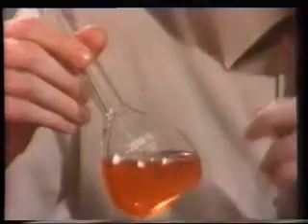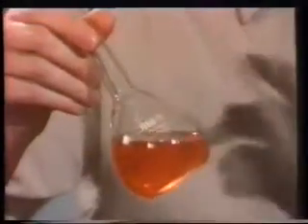Now let's just go back to colour for a moment or two, because there are some things that can produce changes in the colour of urine which you need to be aware of. Of course, the most important is blood. Blood in the urine, very significant, and blood in the urine usually produces a sort of pinkish discoloration like this. You need to be aware of one little warning, that people who eat tons of beetroot, ordinary beetroot, also have a reddish or pinkish discoloration to the urine, so not everything that is pink in the urine is blood.